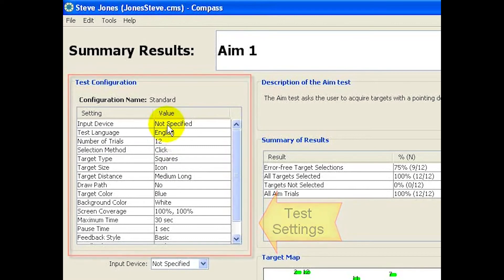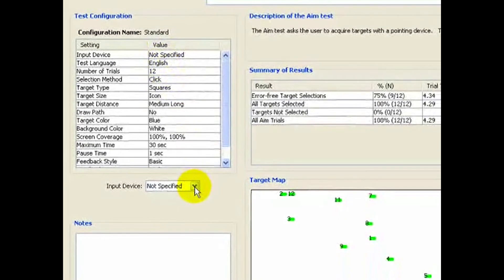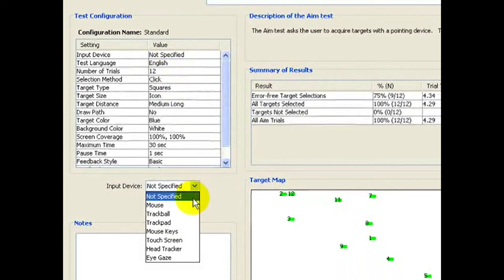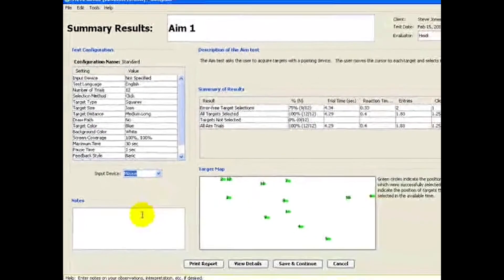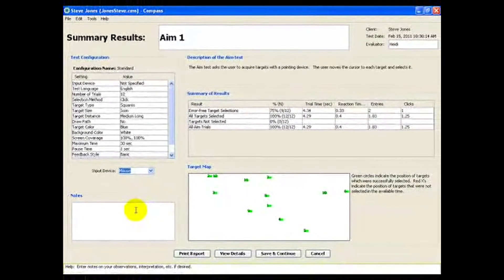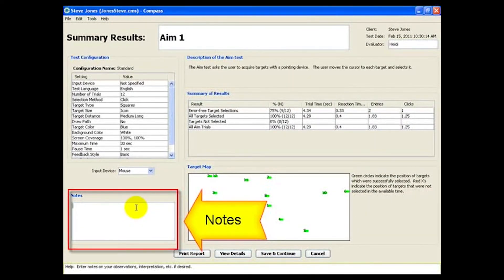Make sure the input device is set correctly, changing it here if necessary. Below, you can enter notes if desired, to record various observations made during the test.